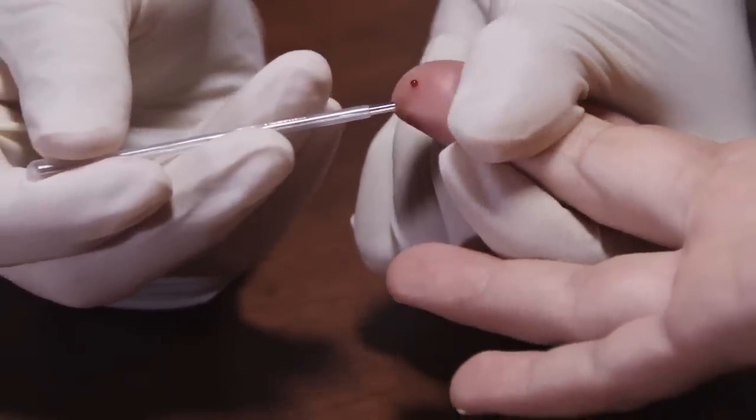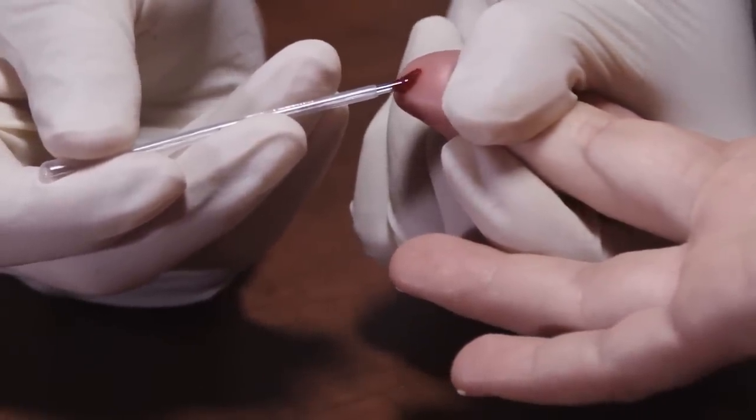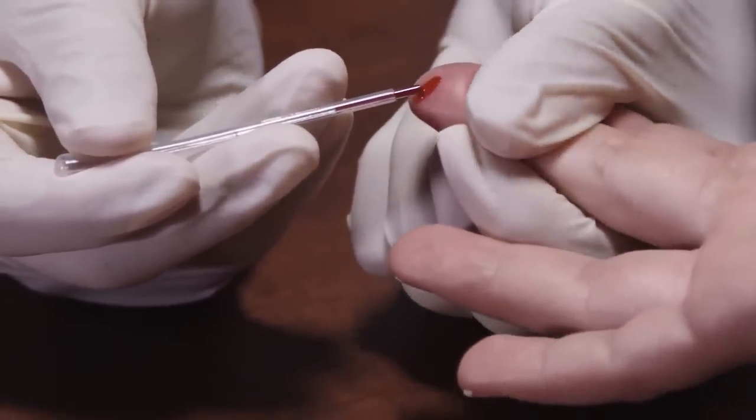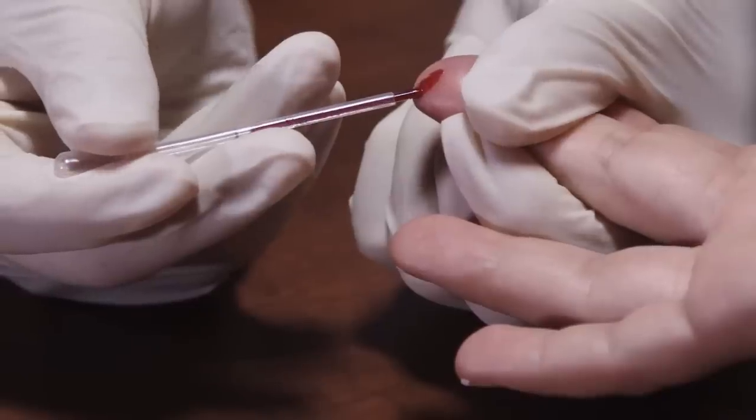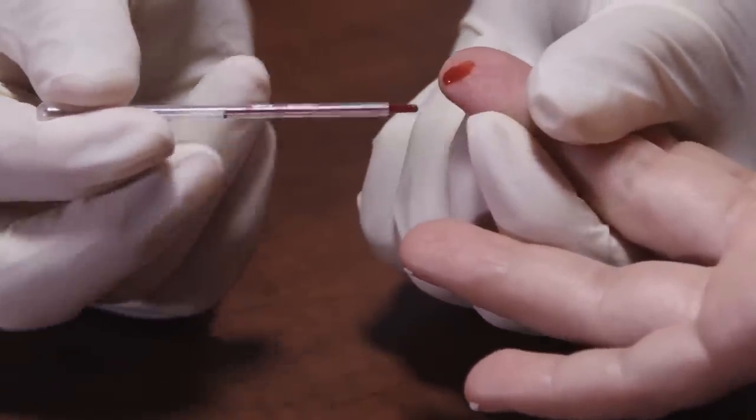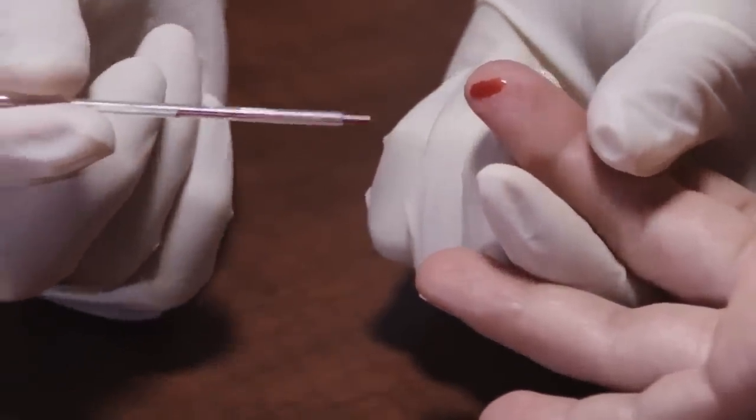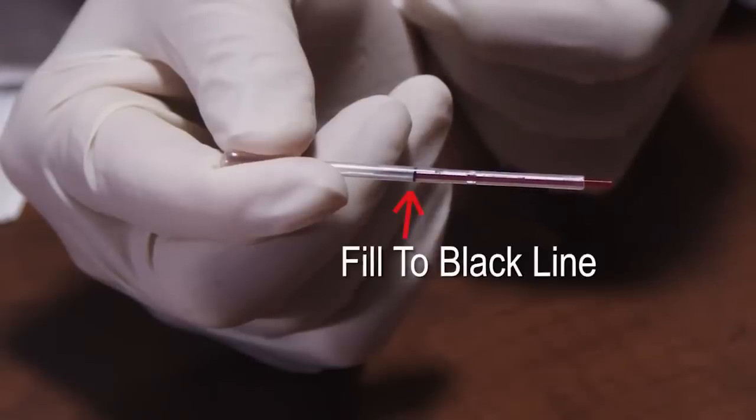Without squeezing the bulb, hold the capillary transfer tube horizontally and use the tip of the tube to touch the blood drop. Blood will flow automatically into the tube by capillary action. Fill the tube past the black line indicator.